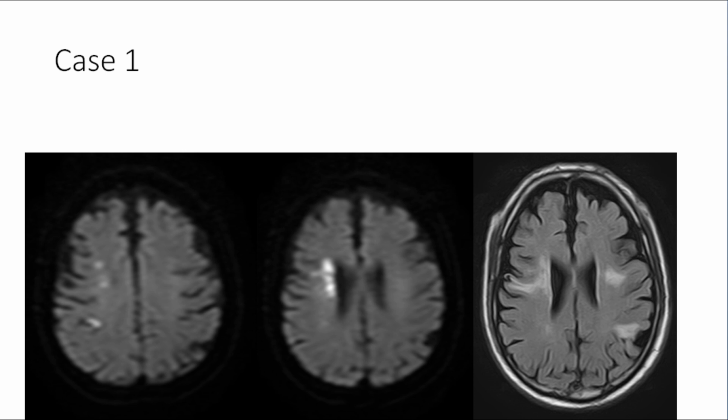I told you the stroke is the biggest burden of neurology. You may be seeing stroke almost every day, many patients. Okay. So what particular type of stroke is this? Okay, any more? So there are like 3 or 4 lacunar strokes at the same time? Any more guesses? It's the same patient over here. What happened over here then? If that was a lacunar stroke, what happened over here?